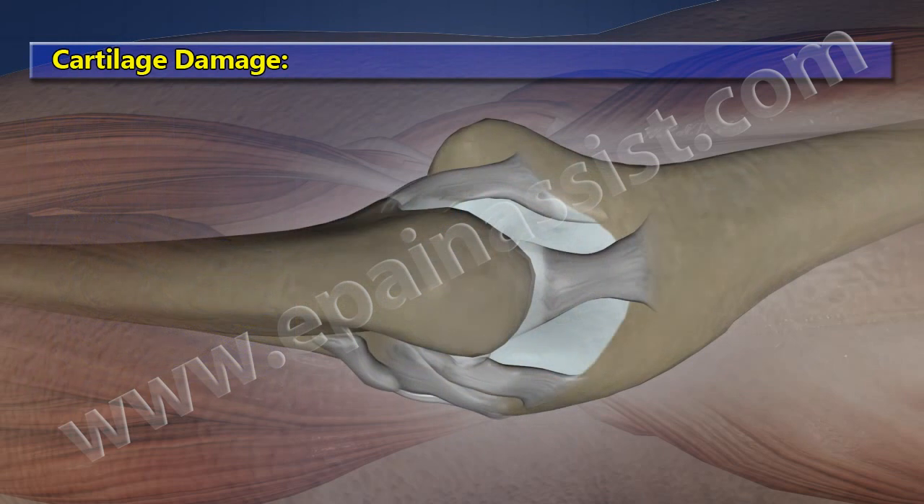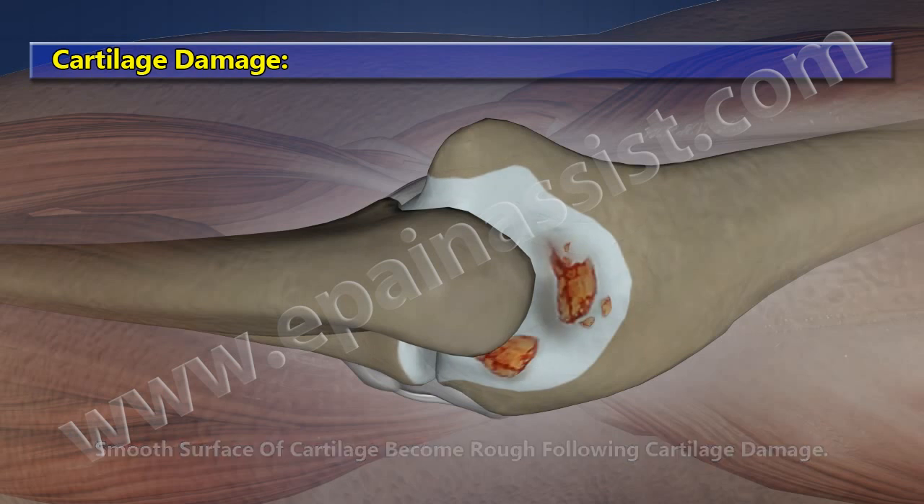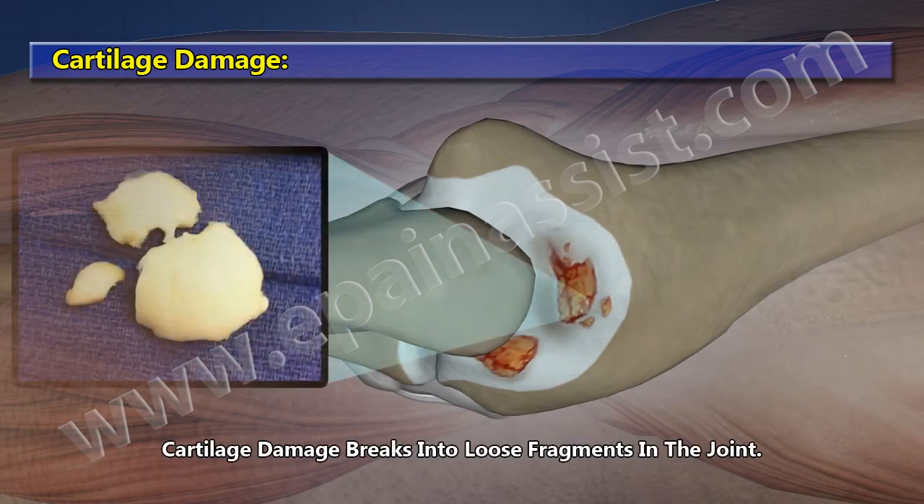Cartilage Damage. The smooth surface of the cartilage becomes rough following cartilage damage. Cartilage damage also breaks into loose fragments within the joint.